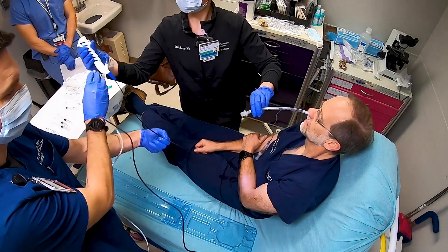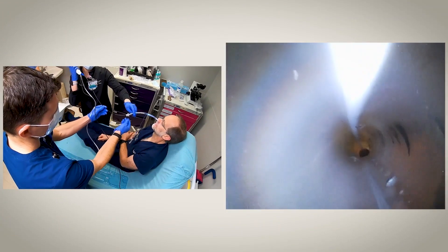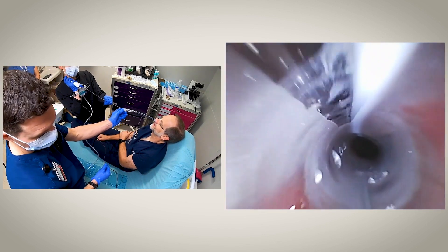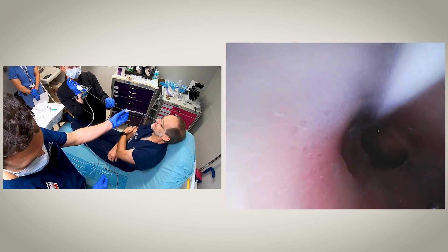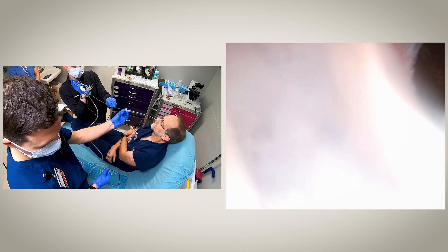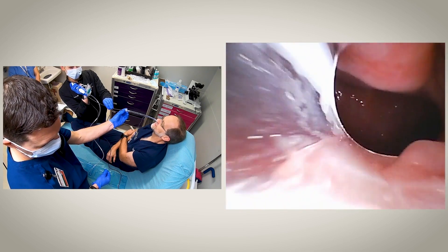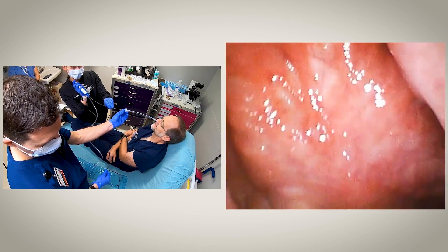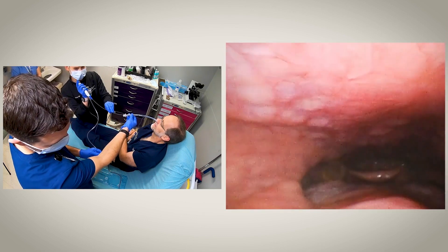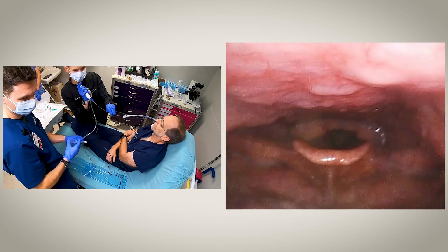Once the tube is inserted in the nose, we will pass our scope through the endotracheal tube — this is where having an assistant is really helpful. We are going to advance the scope down through the tube, come out of the tip, and identify our anatomy. Remember to avoid coming out of the Murphy eye. Here we can see the posterior tongue. We'll advance down past the tongue and the first structure we'll identify is the epiglottis, just down at 6 o'clock on our screen.